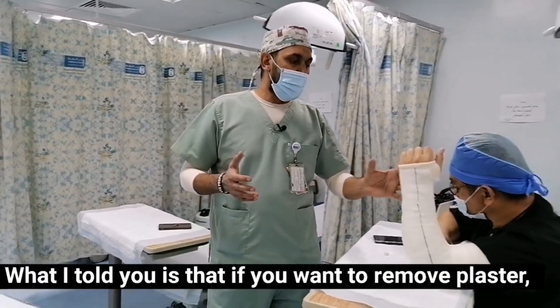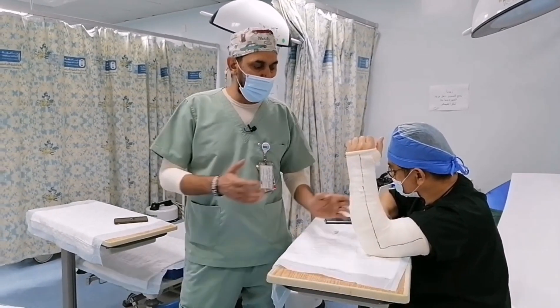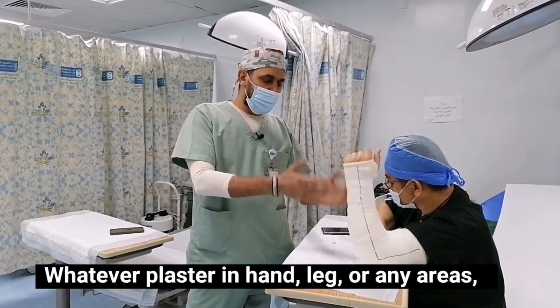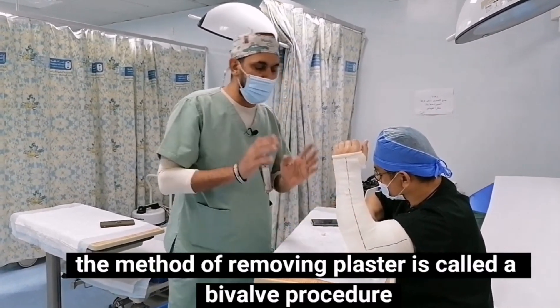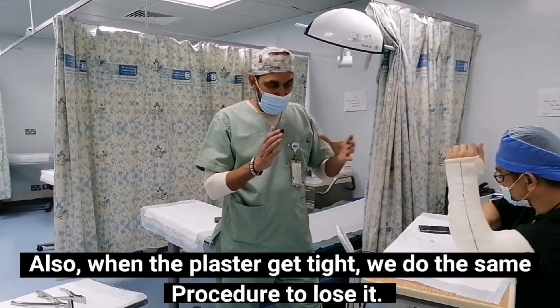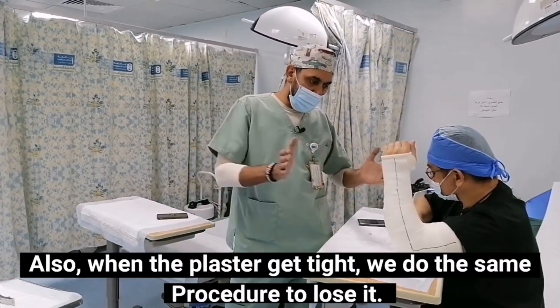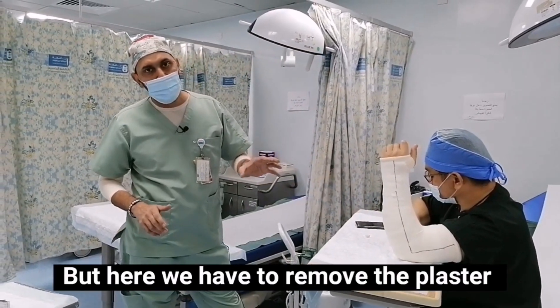What I told you is that if you want to remove the plaster, you can remove it using this procedure — whatever it is, whether in the leg, hand, etc. The method of removing plaster is called the bivalve procedure. When the plaster is too tight, we do the same procedure to make it loose, but here we are removing the plaster.